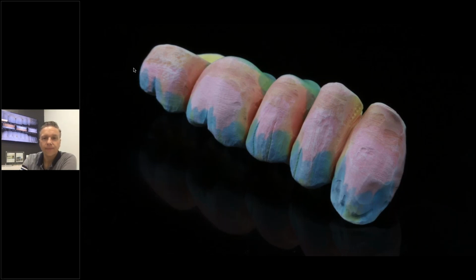Yes, so a lot of questions, a lot of answers. Let's start with the strokes. Yes, it's 1, 2, 3. We answered this already. Compared to the Zolid HT Plus and FX and the regular Zolid, which I don't use anymore, there are definitely differences. For example, the FX needs much more color, much more intense color, than the HT Plus in my experience. The Zolid needs less color than the HT Plus. That's kind of my experience. I explain it by the rising translucency level: we get less prominent, less intense coloring.